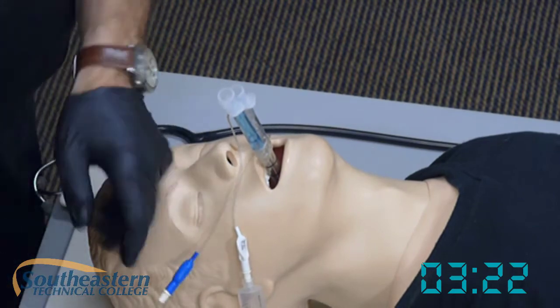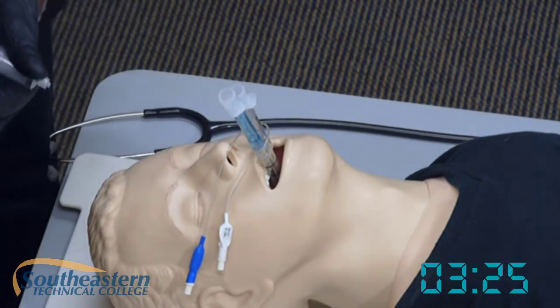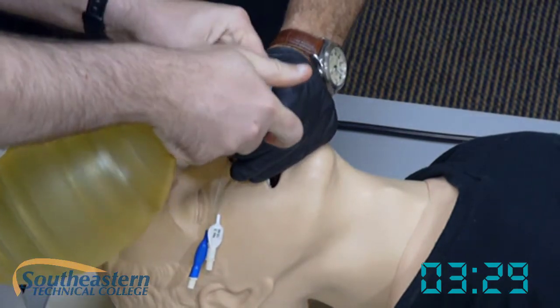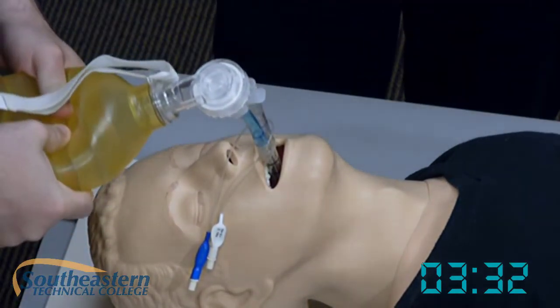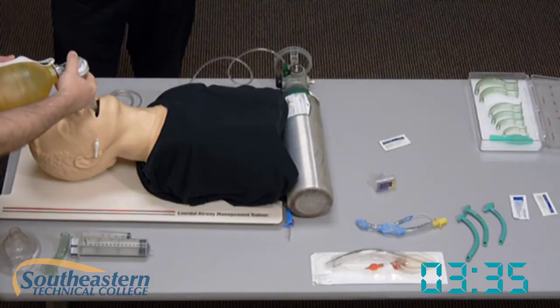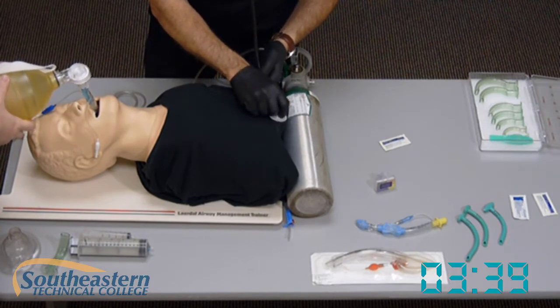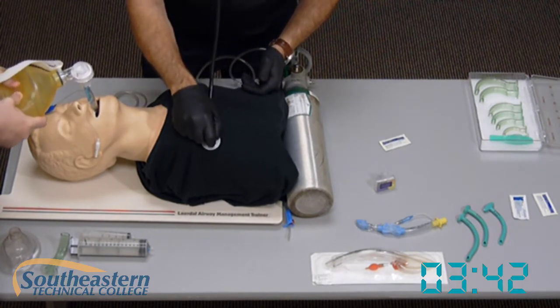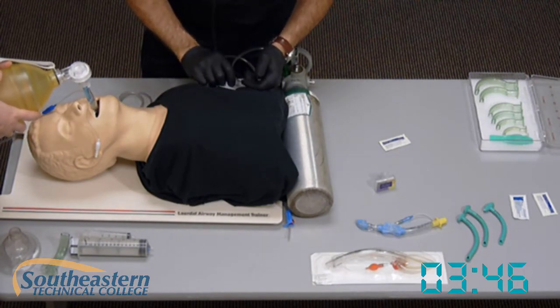I'll inflate 100 milliliters into port one, then 15 milliliters into port two, removing both syringes. I'll have my partner begin ventilations. I'll auscultate over the epigastric region listening for epigastric sounds, then over the right lung, and over the left lung.